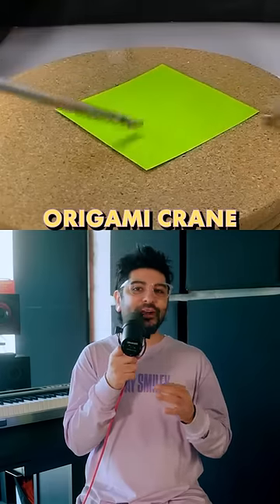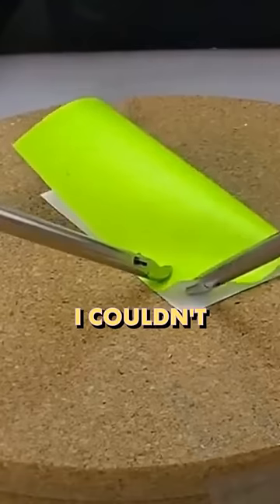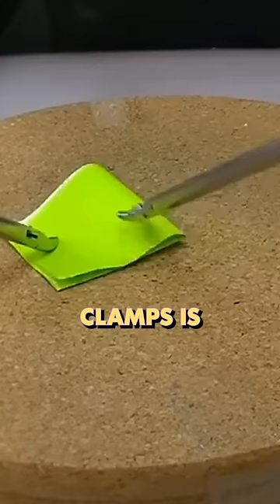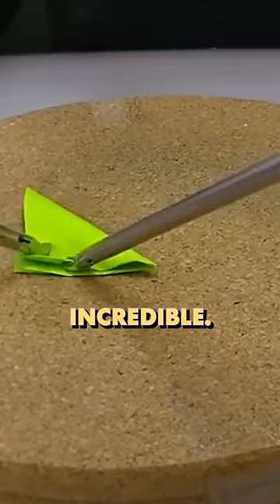This video of a surgeon making an origami crane using laparoscopic clamps is going viral. Now I couldn't even do this with my bare hands. The fact that this surgeon is able to do this with clamps is really impressive. And you gotta wait to the end for the result because it's incredible.